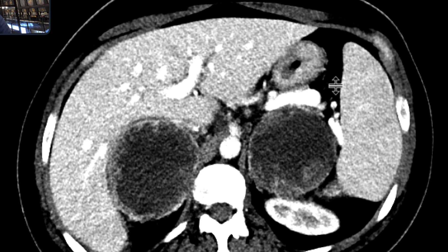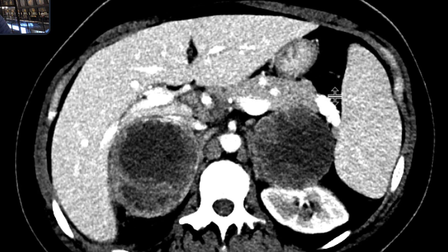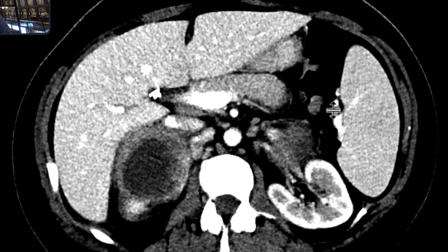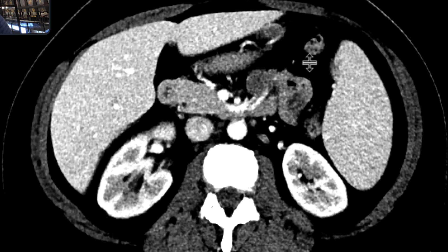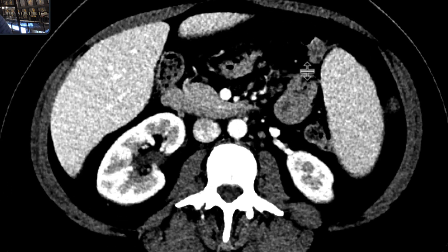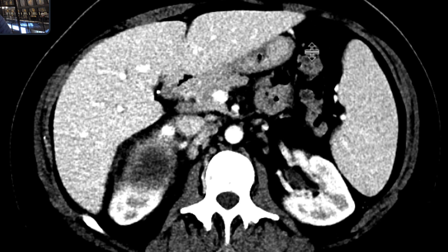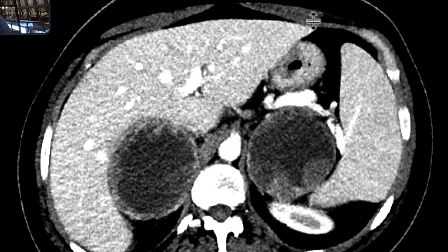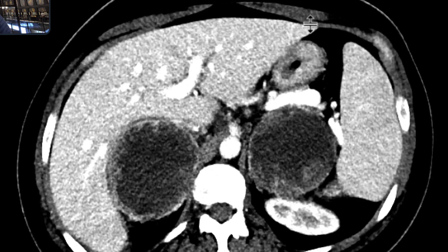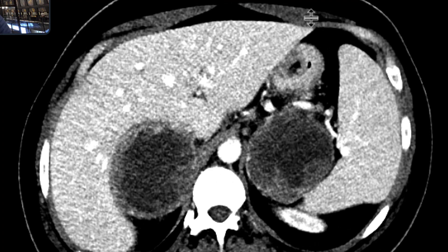If you're suspicious for that and want to corroborate it even more, look for adenopathy around the stomach to confirm your findings. As we scroll downwards, we can see these lymph nodes in the omentum that confirm the fact that our observation is almost certainly a melanoma metastasis to the stomach.